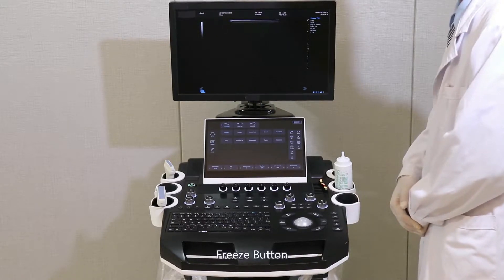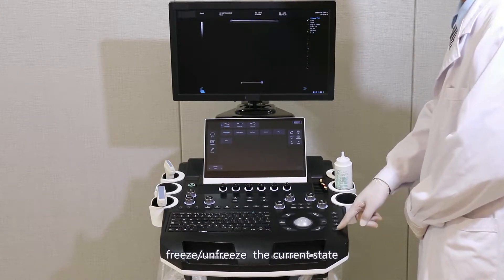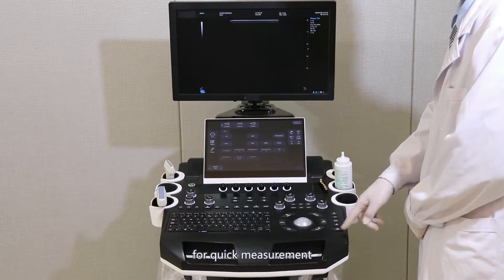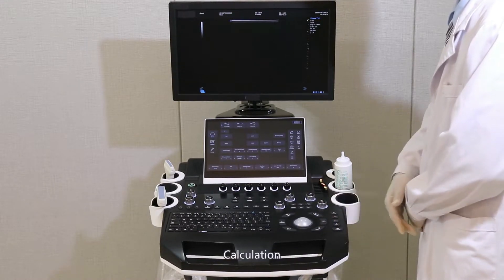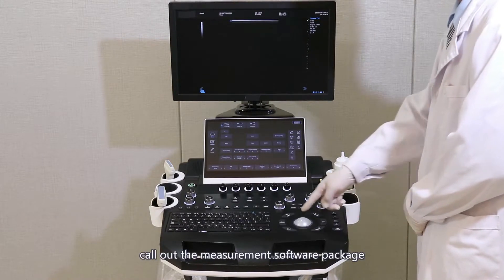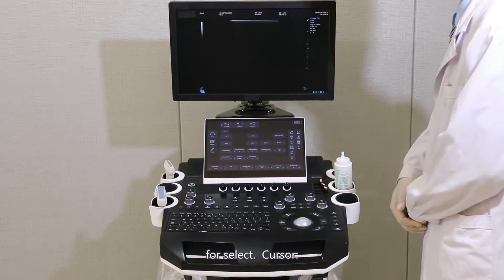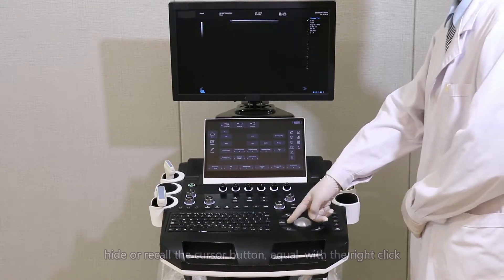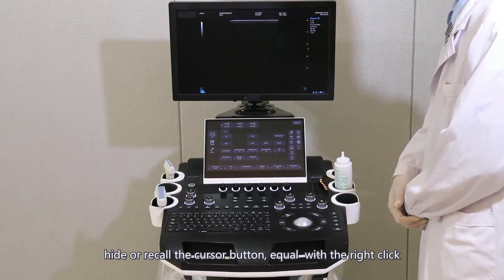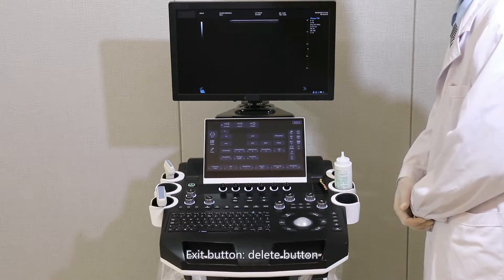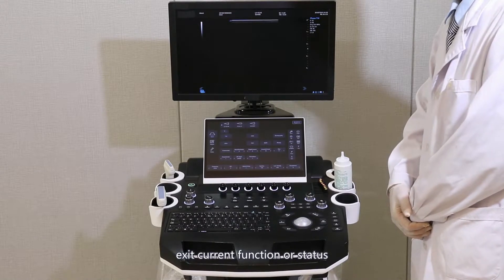Freeze button: freezes and unfreezes the current state. Caliper: for quick measurement. Calculation: calls out the measurement software package for selection. Cursor: hides or recalls the cursor; equivalent to the right click. Exit/Delete button: exits current function or status.